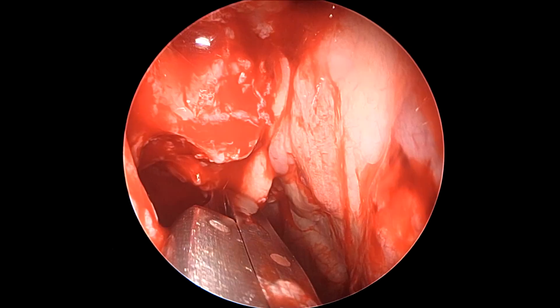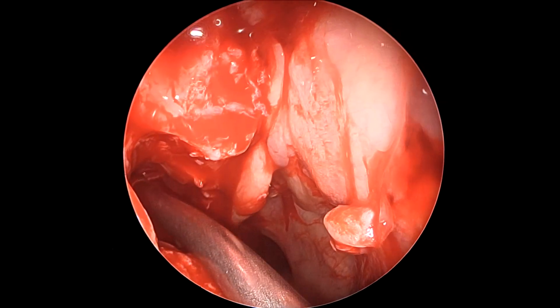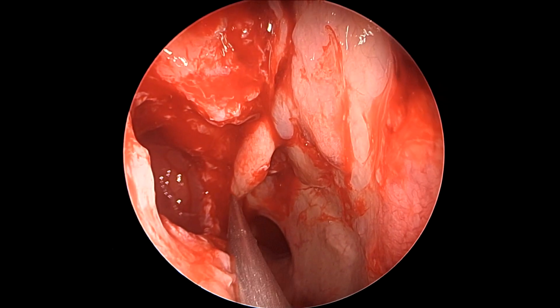Now, as we see here, we can use the straight through-biting forceps to increase the antrostomy posteriorly, and then use curved suction just to clear the contents of the maxillary sinus. There could be fungus, in some cases polypoidal tissue.